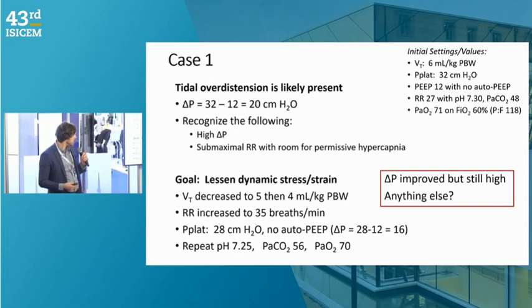So now that our airway driving pressure is lower, how do we feel about this patient? Would we leave them here and say, okay, we're at a driving pressure of 16, we moved on tidal volume, that's good enough? Or would anybody take additional steps?